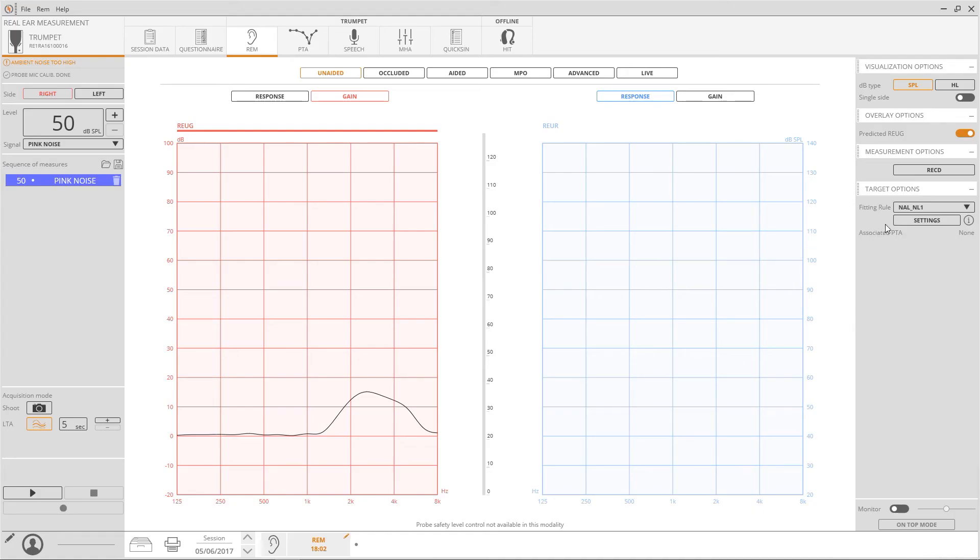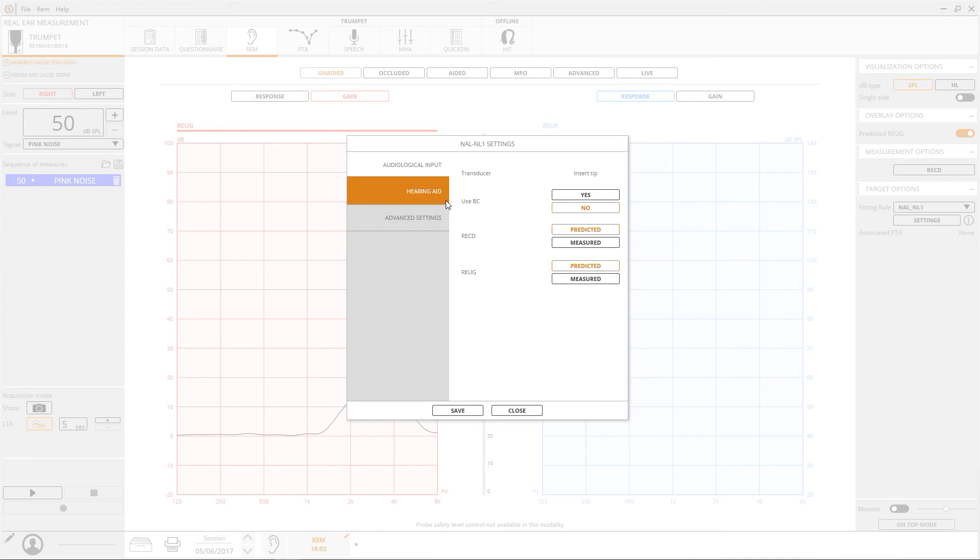The fitting rule can be set from the drop-down list on the right panel. Press settings to customise the parameters.